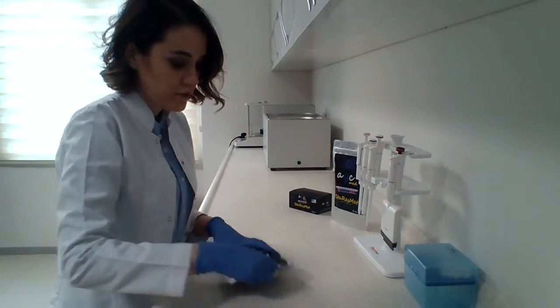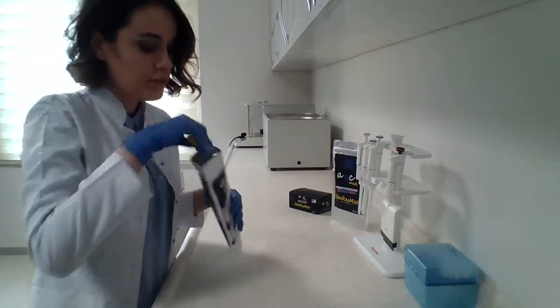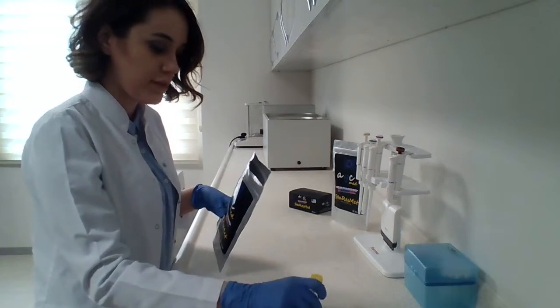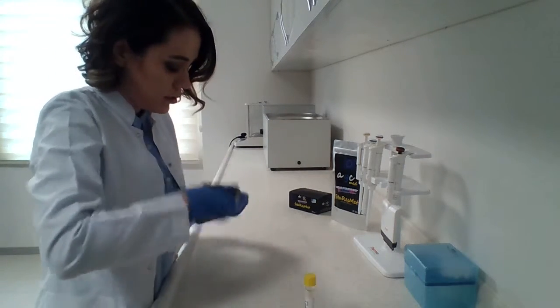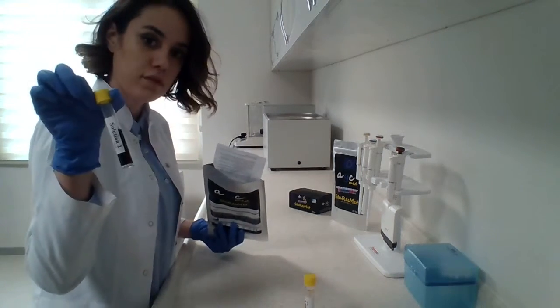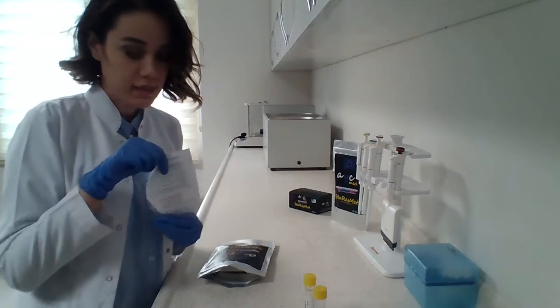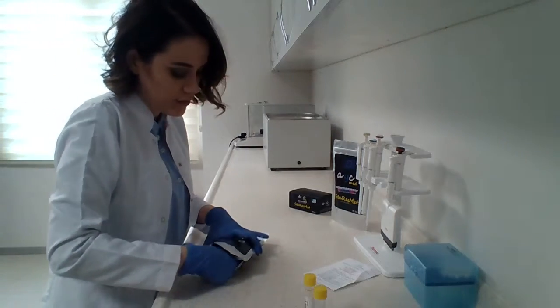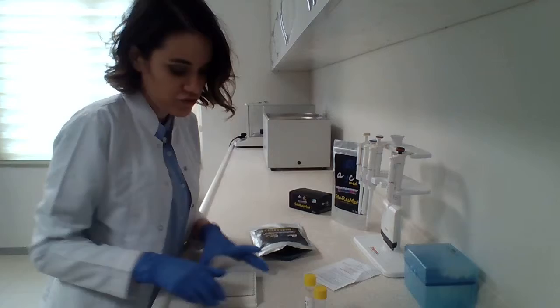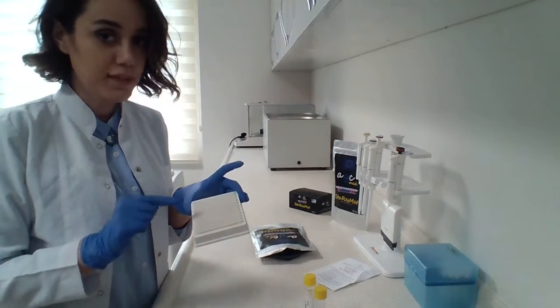First of all, we have the box of the kit, and there will be solution 1 coming out of it, and the solution 2. Also the procedure of the kit. On top of that, we have the strips. There are 12 strips in order to apply the procedure.